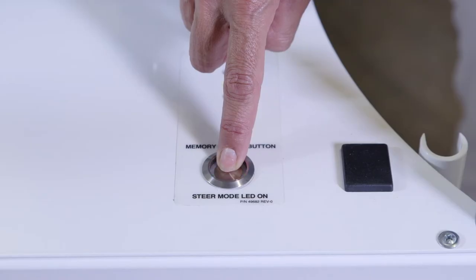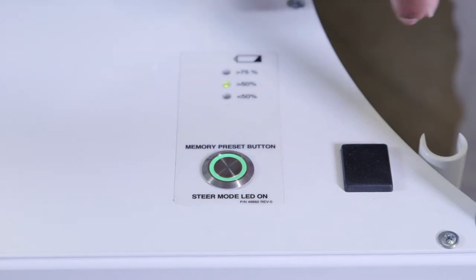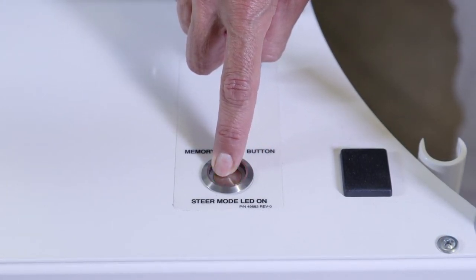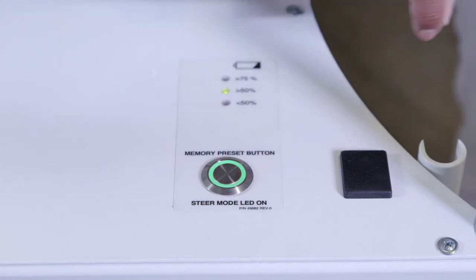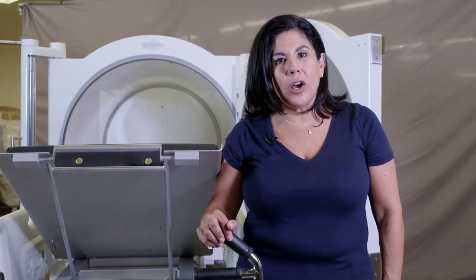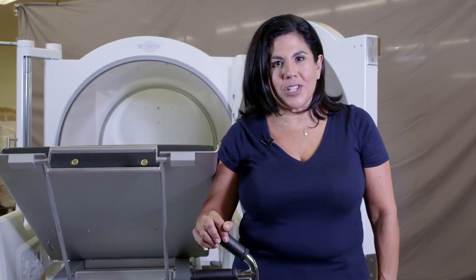One of the daily challenges we know all of our users have is figuring out when the gurney is at the height of the chamber rails. Well, we solved that problem for you. We have a memory pre-set button — a simple press of the button, three flashing lights, and your gurney will always stop at this pre-set height. You can raise and lower and it will always come back to this position.